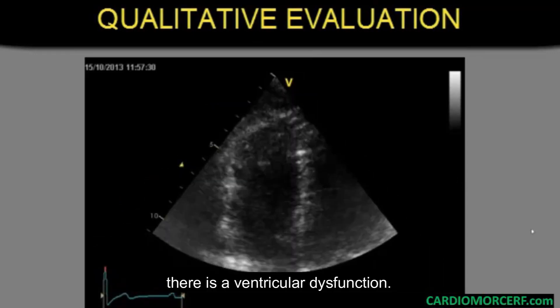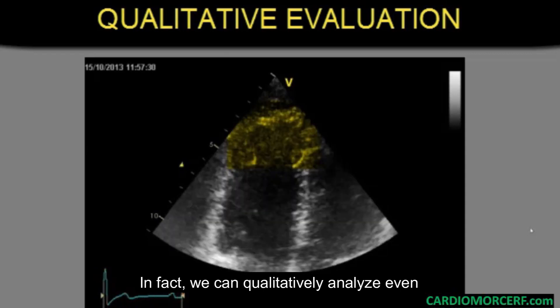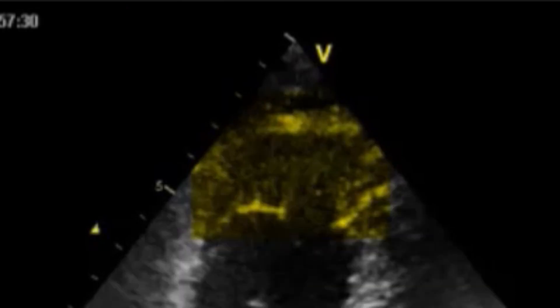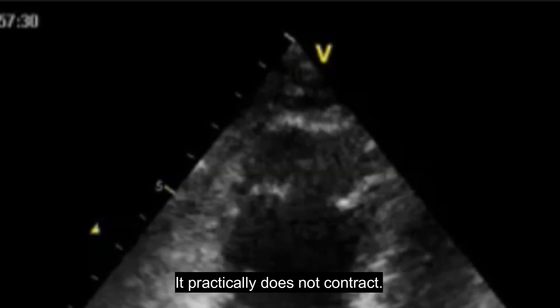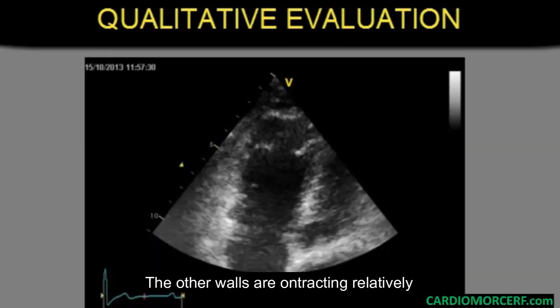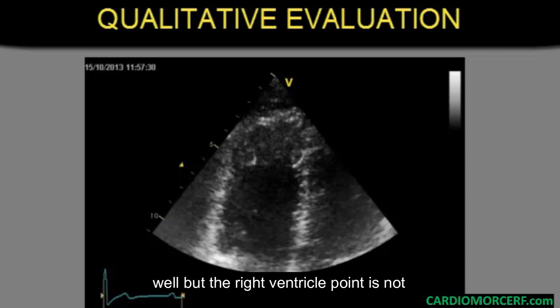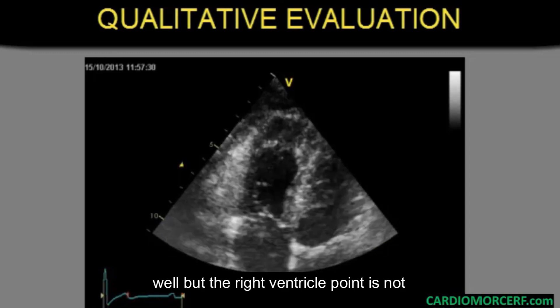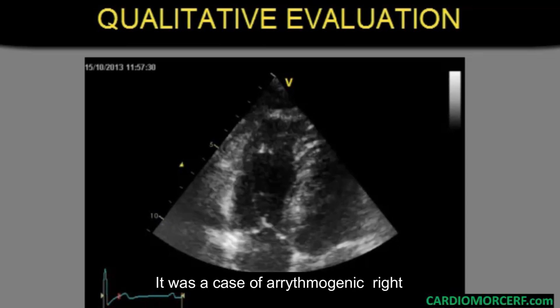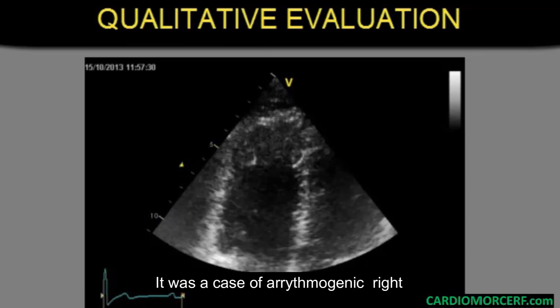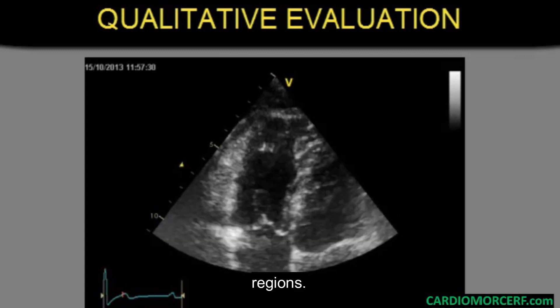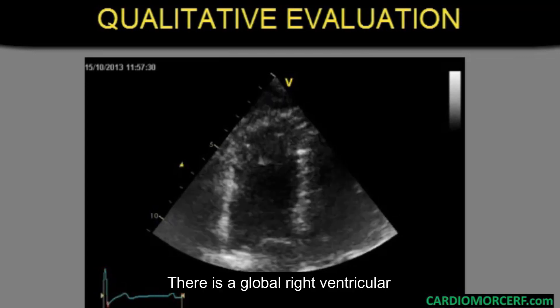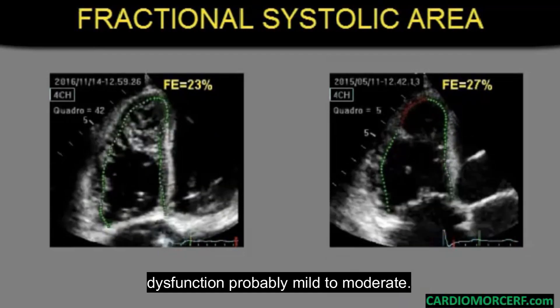There is no active contraction in these walls; therefore, there is ventricular dysfunction. In fact, we can qualitatively analyze even localized problems, as seen in the right ventricular tip — it practically does not contract. The other walls are contracting relatively well, but the right ventricular apex is not contracting. It was a case of arrhythmogenic right ventricular dysplasia. Although the basal regions contract well, there is global right ventricular dysfunction, probably mild to moderate.